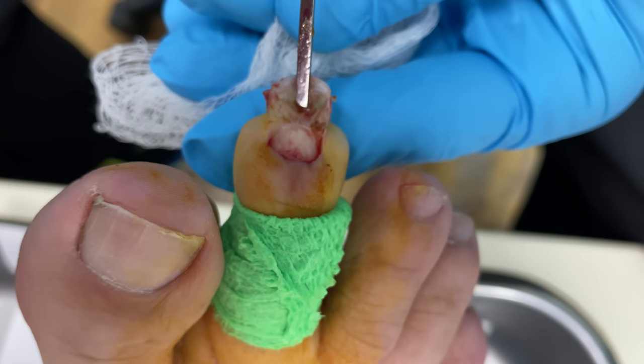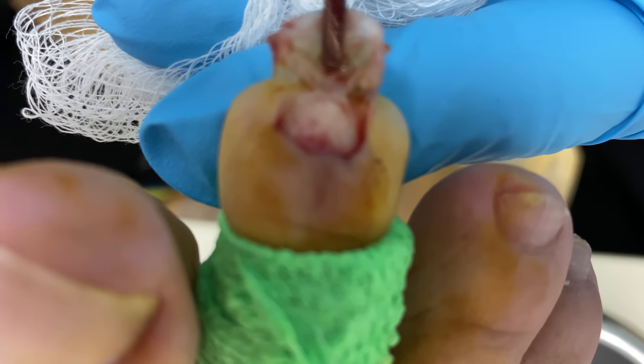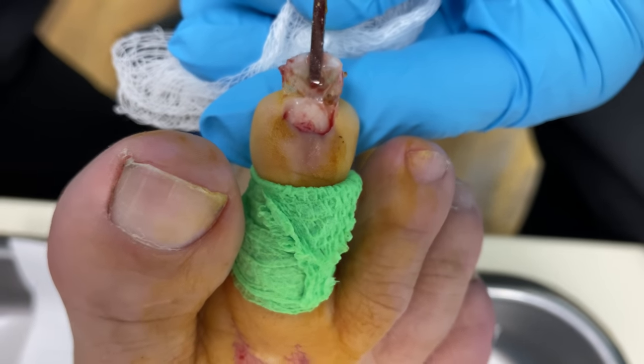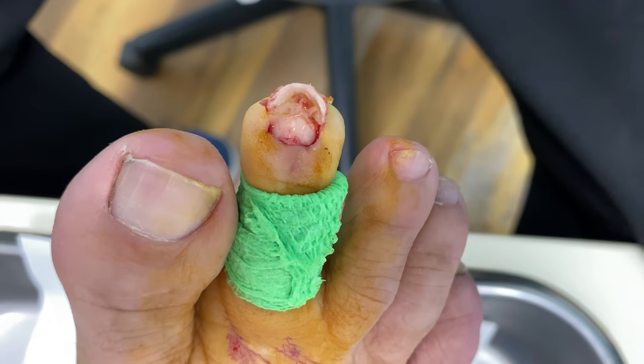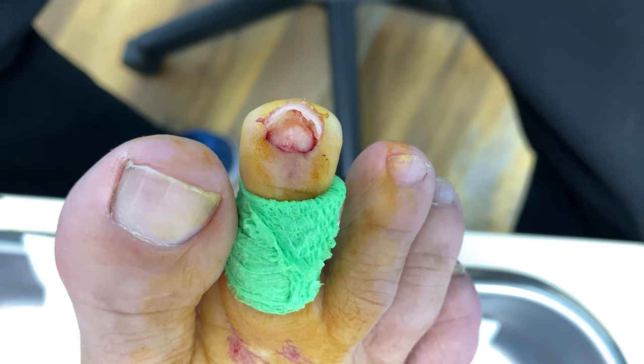Let's focus in on that. Can you get it in focus? There we go — let's see if we get closer. So that's what it looks like underneath the nail bed. Very little trauma. Now we're going to take that off of there. We can let it hang for a second because it's kind of cool looking to see that.